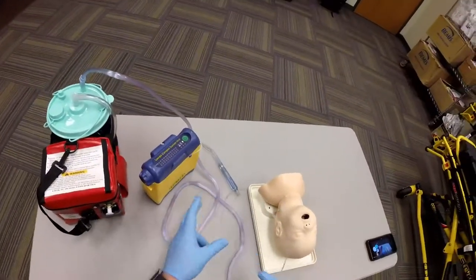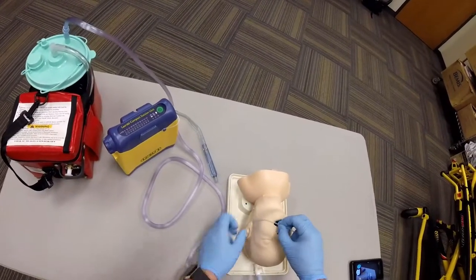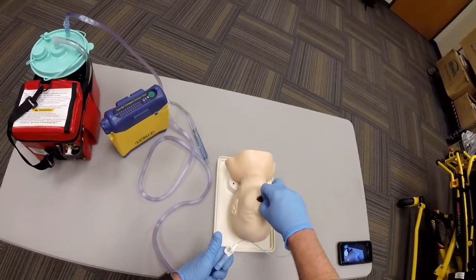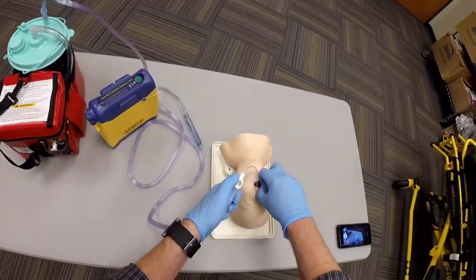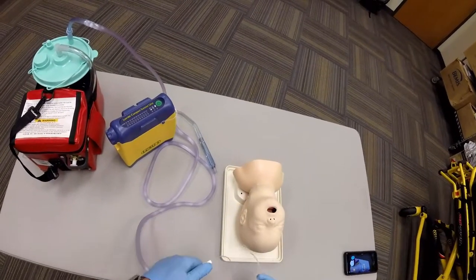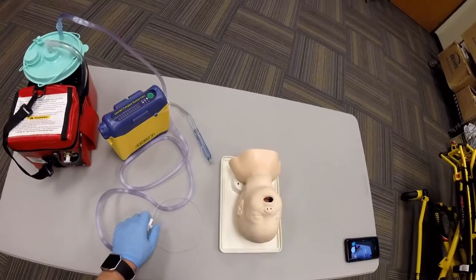You will measure your catheter from earlobe to the corner of the mouth. You will insert the device. You will occlude the suction on your way out, and it should take no longer than 5 to 10 seconds. Reassess your patient.